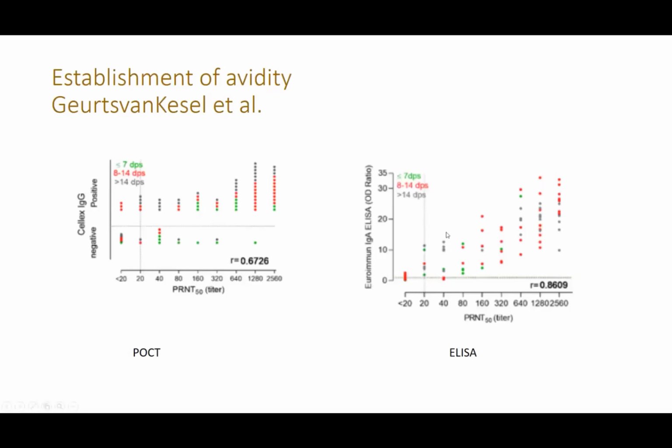So I am hoping that our next generation of antibody tests will have a claim against virus neutralization, a certain degree of correlation which would give us some idea if an individual is in fact immune or not. Virus neutralization is not a perfect test.